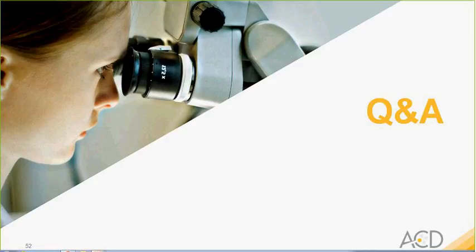How short of an mRNA can RNAscope detect? Again, an excellent question. We described the typical scenario of roughly 20 double Z probes being the ideal number to detect a single messenger RNA molecule. But we know that as few as 3 double Z pairs can lead to the detection of a single molecule.